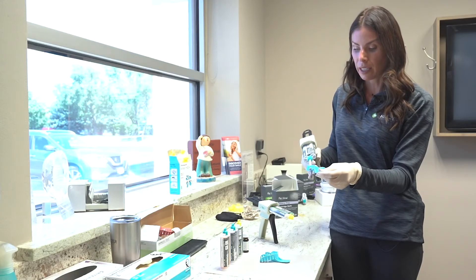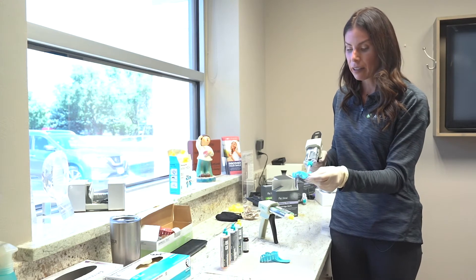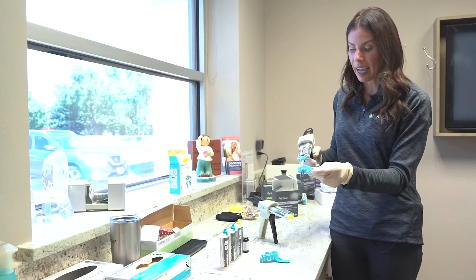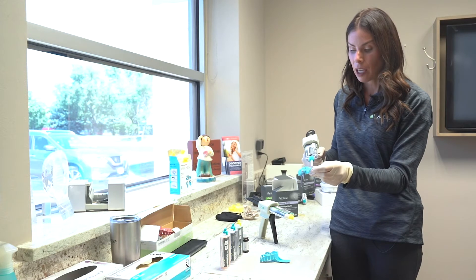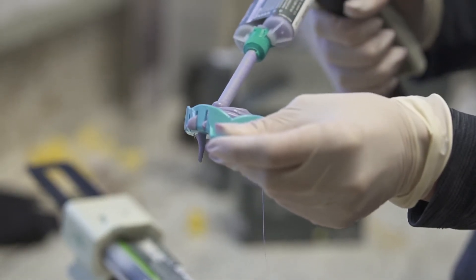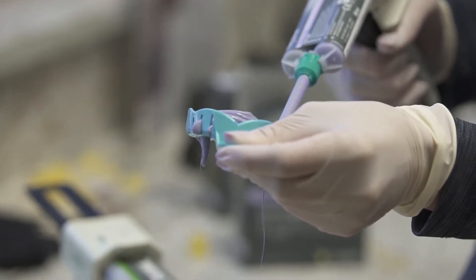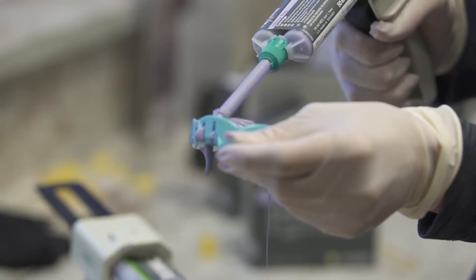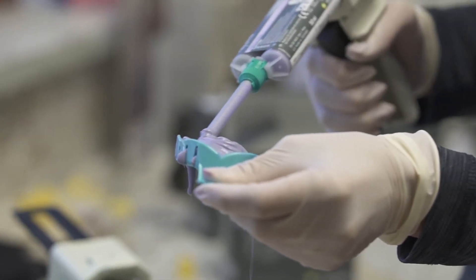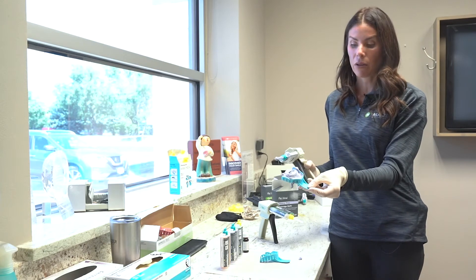The most common error is removing the tip from the tray material — that is a no-no. The reason is that air gets inside the impression material through that syringe, and that's when you'll see voids, because air has been introduced. You always want to keep that tip submerged inside the material and never pull it out.